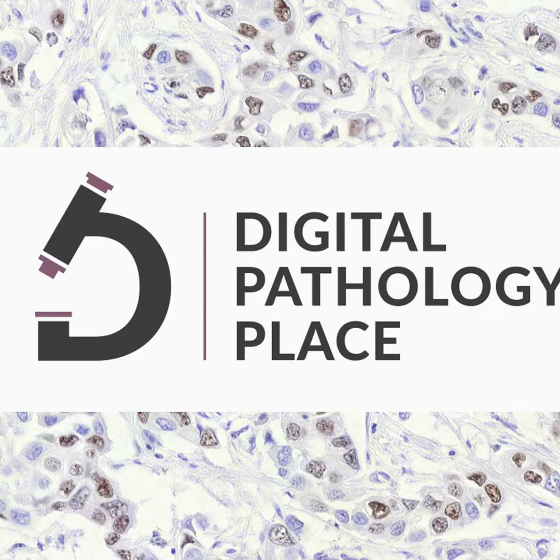And then maybe just an understanding of why it's a system. The idea here is that the comparator device for pathologists to make a diagnosis is the microscope, right? What do you need to make that work? Well, before there was electricity, you needed a good mirror lined up against the sun. But now that we have electricity and light sources, you basically need an electric plug, and then you pretty much trust the pathologist to do what they do. A scanner will not serve that purpose, right? If you have a slide scanner on your desk, you put the slide in, it scans, and then you need something to read it, right?